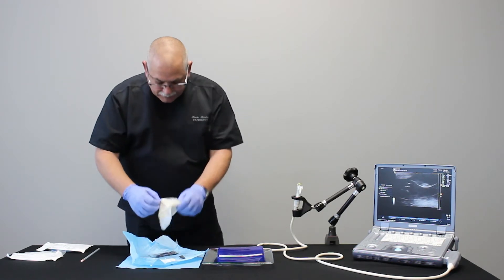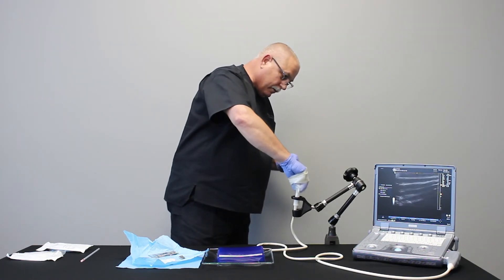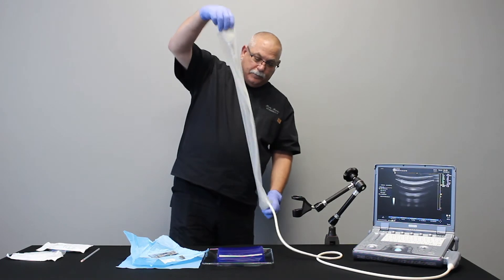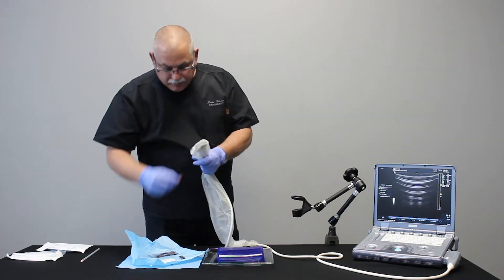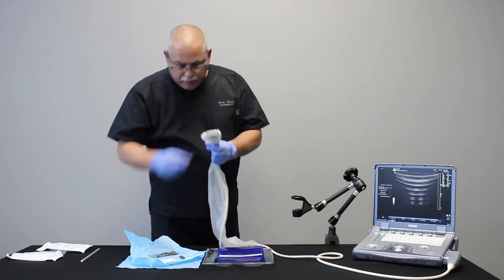Next I'll take the probe cover, grasp the probe, and then pull the cover down. Then use the elastic bands to secure the cover onto the transducer.